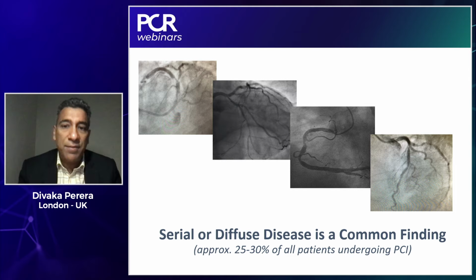Thank you, Bernard, and thanks to everyone for tuning in. So why have we got a webinar on serial and diffuse disease? It's because it is a very common finding. If you consider all of the patients who undergo PCI who then have physiology, probably a quarter to a third will have one of these patterns of disease rather than just an isolated focal coronary lesion. You'll see serial lesions on the leftmost screen, a combination of serial and diffuse disease on the next panel, and so on. If you just focus on the patient represented in the third panel, I'll take you through some of the ways in which we assess this artery.